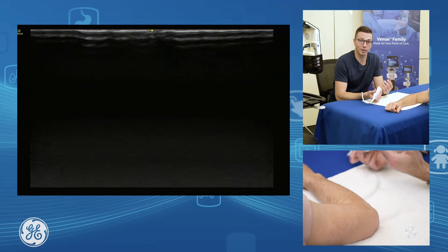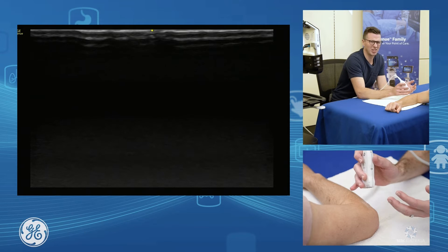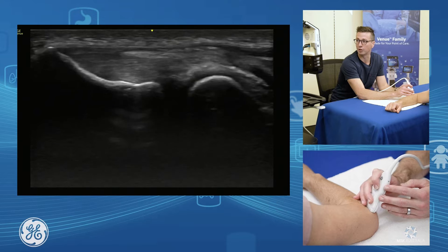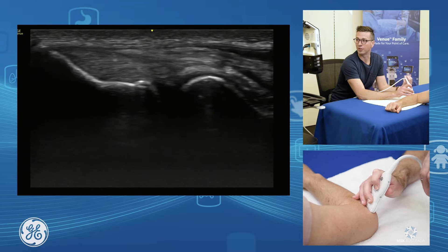Ultrasound assessment of lateral epicondylalgia — our primary focus is on the common extensor tendon. The common extensor tendon is a really easy tendon to assess. We grab our probe and pop it on in longitudinal along the tendon. As we move through, we can assess the bulk of the common extensor tendon.